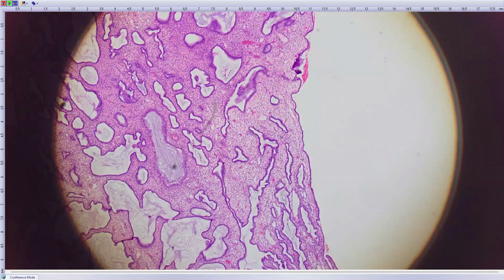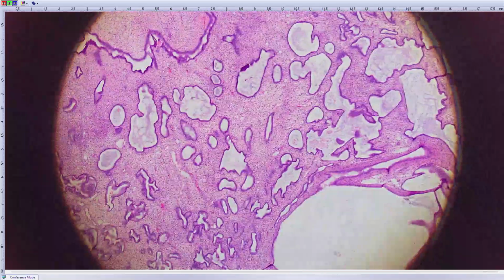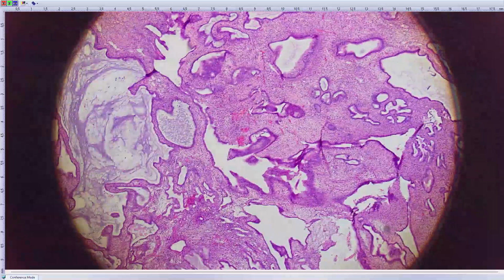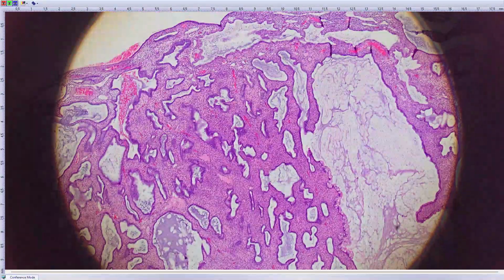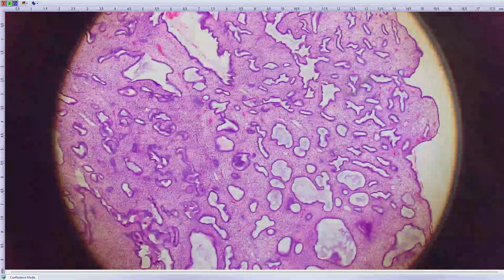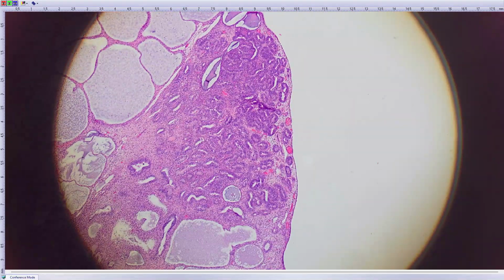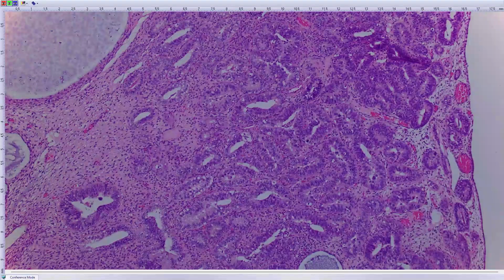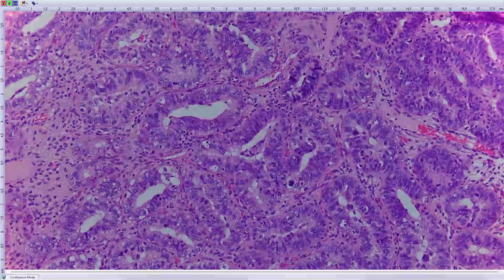My next case is an older lady, and this is an endometrial polyp, and this is just to remind you that when examining these polyps, we always have to be really careful not to miss important lesions there. I always examine the whole surface of the polyp, because you may find this. It is glandular looking, a little bit reminiscent of an endometrioid lesion, but in fact it's not.